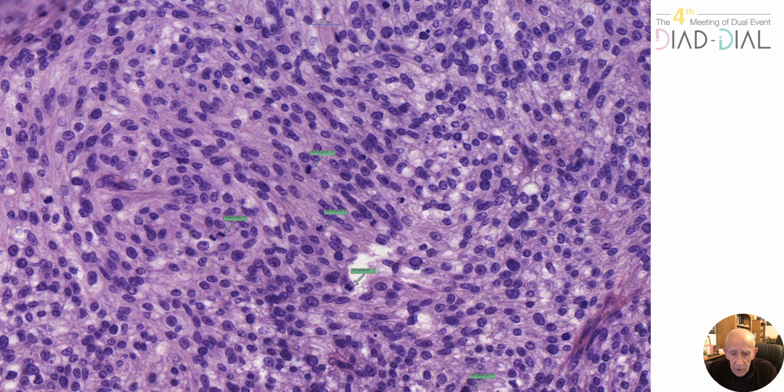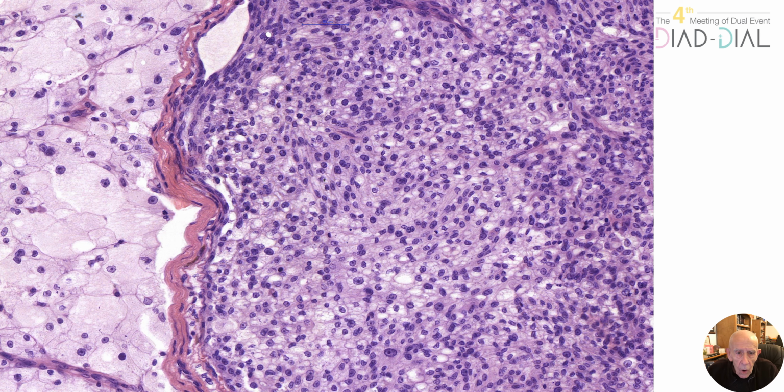And then lastly, I wanted just to show you a case. This is a case that Antonina Kalmykova kindly shared with me, and I showed it at a meeting in Dubai. And so I'm looking at it backwards. And if you look at it backwards, what you're looking at are undifferentiated cells, many of them showing cytoplasmic vacuolation. Lots of mitoses. There are five annotated there, and in fact, I can see a sixth. So if you took that field on its own, that could easily be a sebaceous carcinoma in which we're not getting good germinative cells.